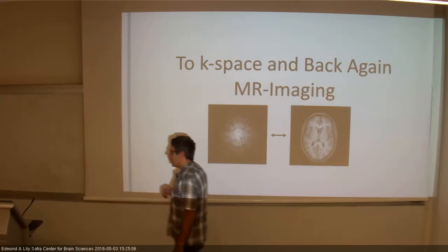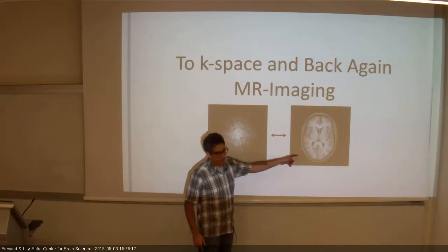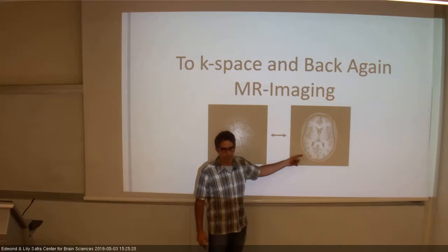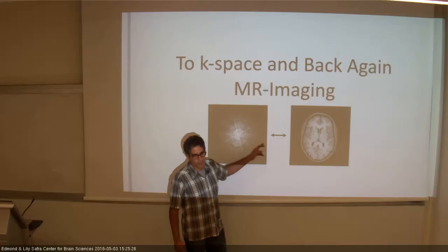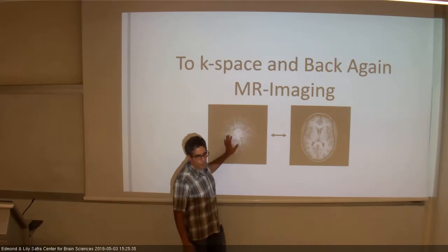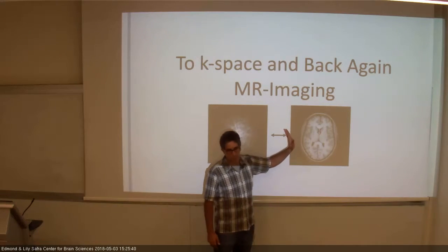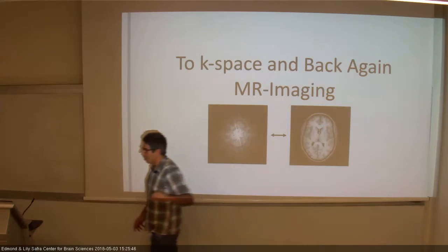And the even more complicated thing is that actually we're not going to measure an image. We're going to measure in a different space, what we call K space, essentially the Fourier space. This image, everybody did Fourier, right? Okay. So this is a 2D Fourier. We're going to explain what it is exactly, but we actually measure in this space, and only afterwards we're going to do the inverse of the Fourier and create an image. So all the measurement is going to be here. There was another Nobel for that.